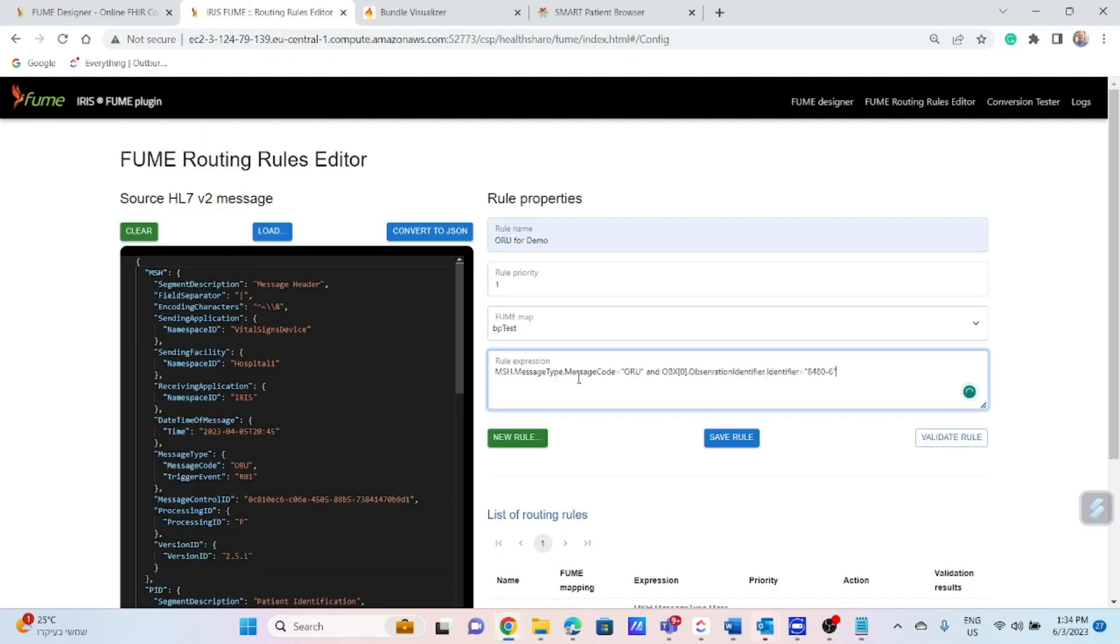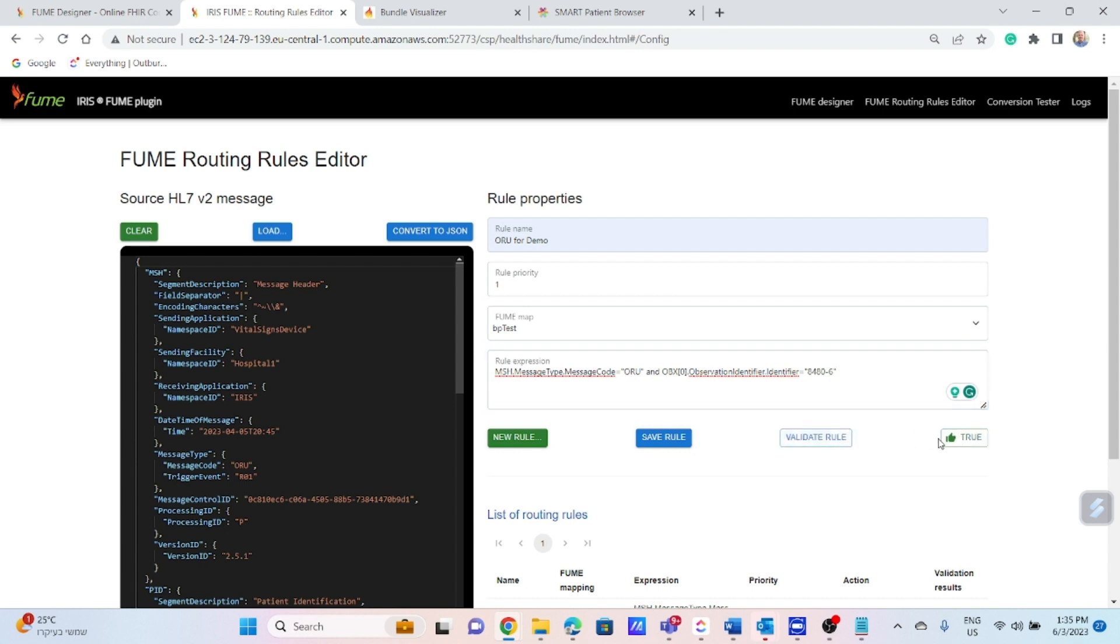In our case, we will base our rule on the message type and blood pressure observation code. Now, the last step, we can validate the rule, make sure that our rule works in an appropriate way and save the rule.